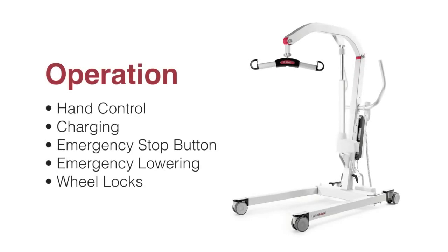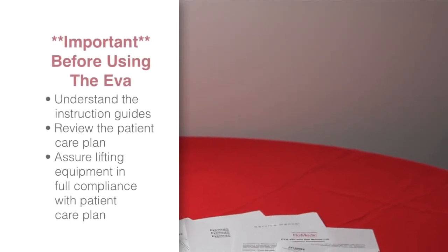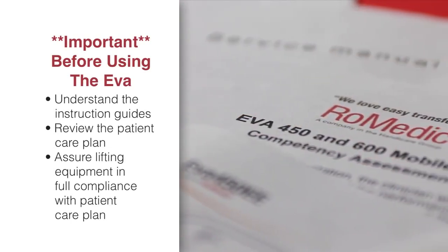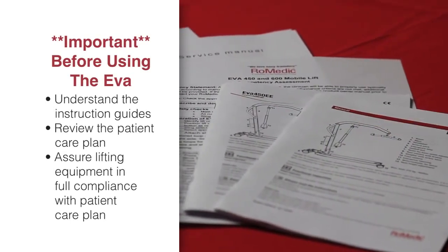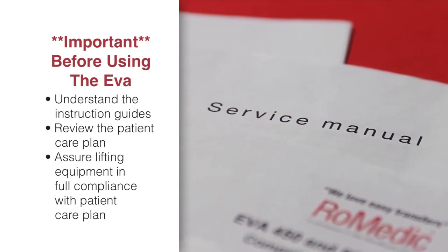In this section, we will briefly review some of the operational features of the Eva, including the hand control, charging, emergency stop button, emergency lowering, and wheel locks. Before using the Eva, all operators should carefully study and understand the instruction guides for both the lift and accessories, as well as complete the Eva competency checklist. In addition, the patient care plan should be reviewed for the patient's activity level and any contraindications for using a lifting device. Assure that the use of the lifting equipment and accessories is in full compliance with the patient care plan.